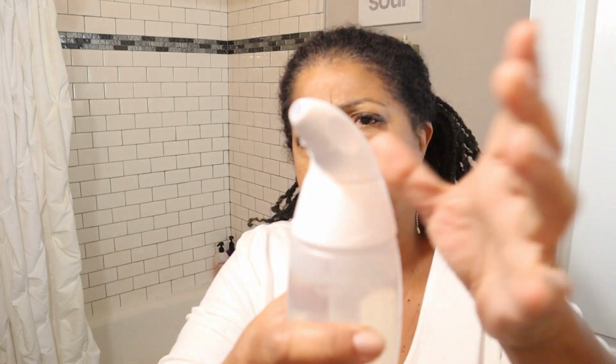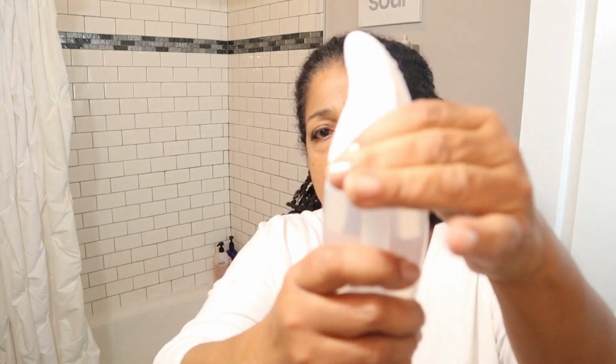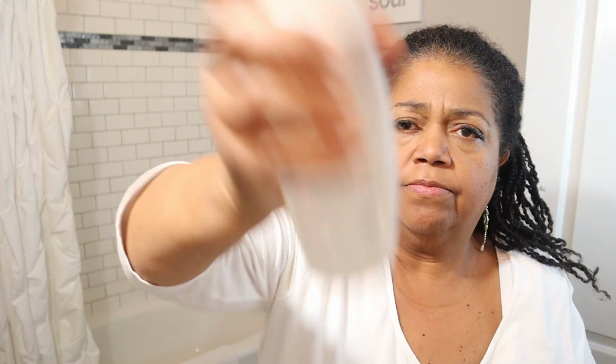Once you have the water and the saline in the squeeze bottle, you're going to attach the nozzle or the applicator, and you're going to screw it on till it's tight. Then you're going to take your pointer finger, or whatever finger you feel comfortable with, and cover the opening of the applicator or the nozzle and shake well to mix the saline with the water. Then you're going to proceed with the rinsing of the nasal passage.